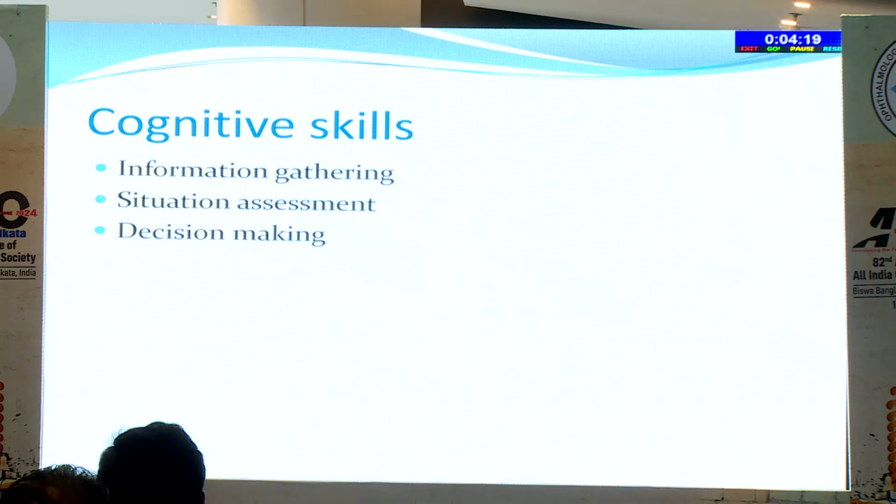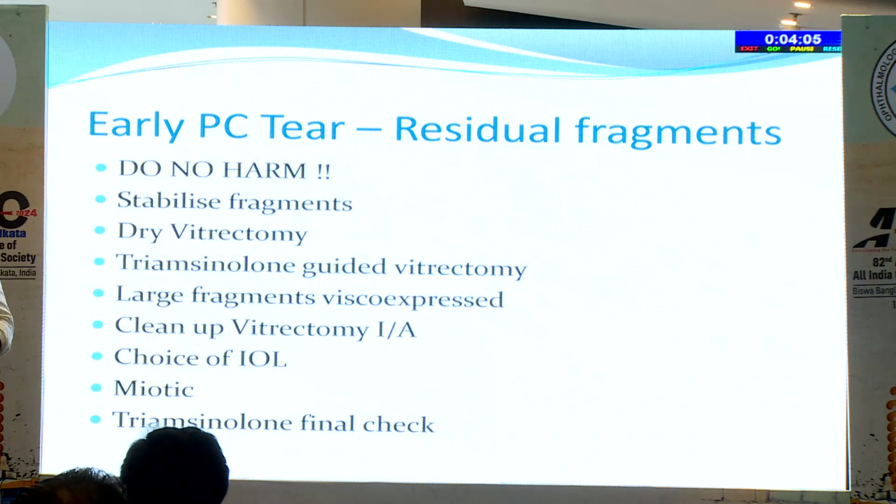Do I need to hand it over to a VR surgeon at this point? Can I go through the same size wound and continue with phaco? Or do I need to extend? Do I need to visco express the fragments? This is very important. Take a minute or two and then go ahead. And regarding the surgical skills, do no harm. That's very, very important. So stabilize the fragments.